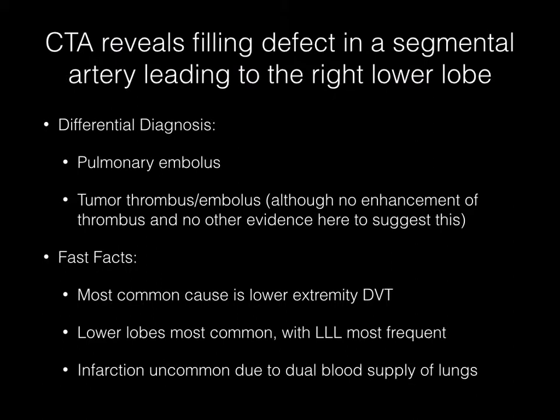This axial CT angiographic image of the chest demonstrates a filling defect in a segmental artery leading to the right lower lobe. The differential diagnosis includes pulmonary embolus and tumor thrombus or embolus. However, there is no enhancement of the thrombus on this image and no other evidence to suggest anything other than a bland pulmonary embolus.